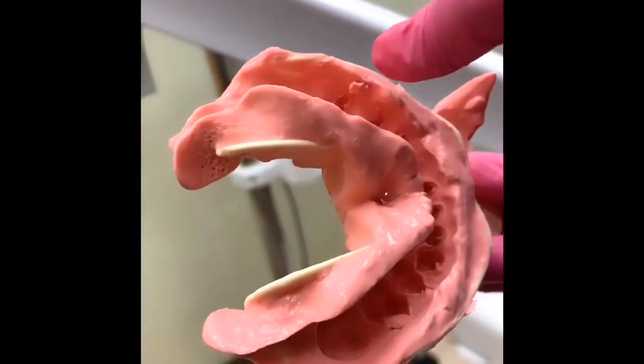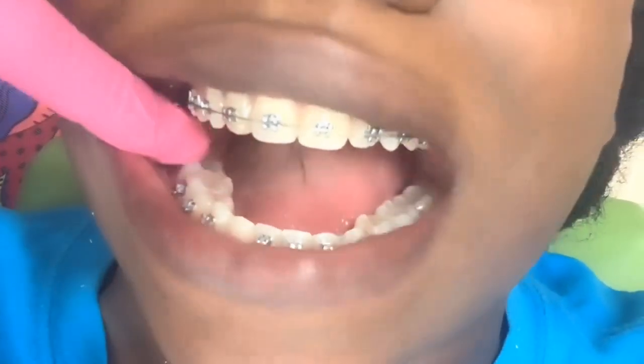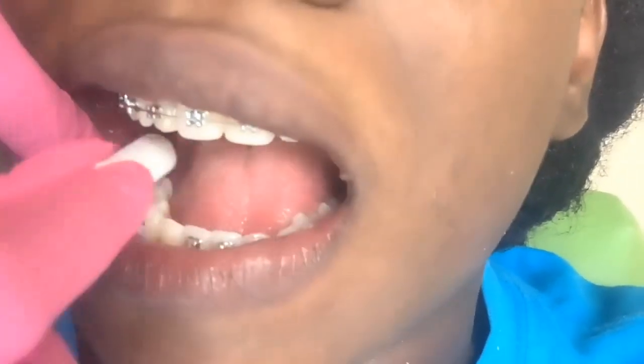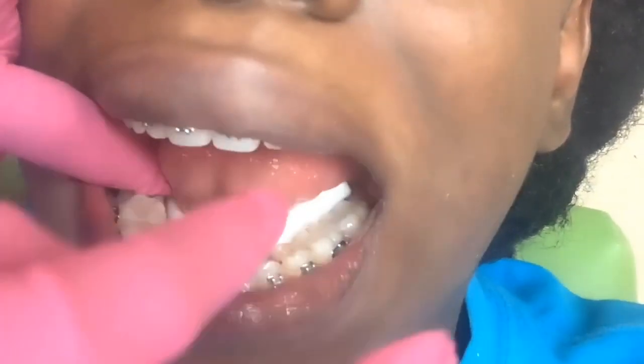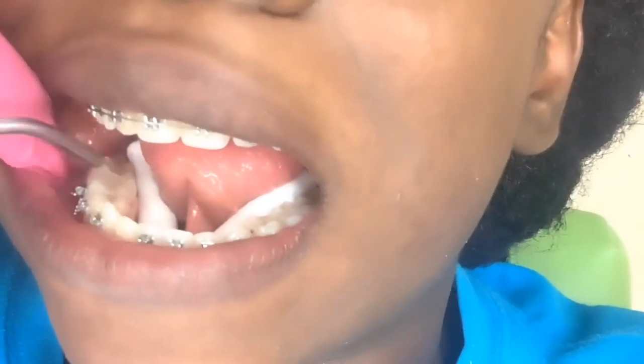So then, I finally calmed down and I stayed still, and then she took it out, and this is how it looking. See, she got all my teeth, and this is what my mouth looks like without the tongue screen in. And then she's about to put the tongue screen in because I can't do without it, because my tongue has a brain of its own and it does whatever it wants to do, and I don't want it messing up my teeth again. So we have to make sure we keep that tongue screen in for the whole treatment.